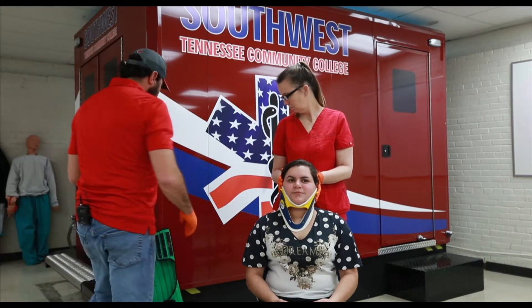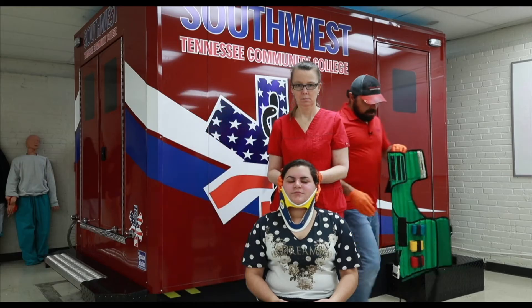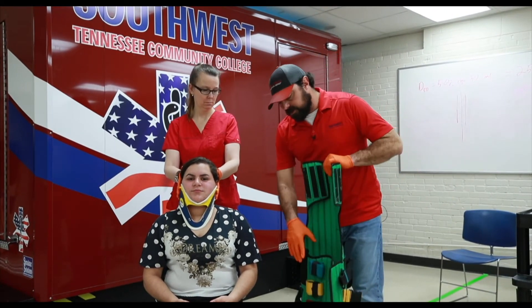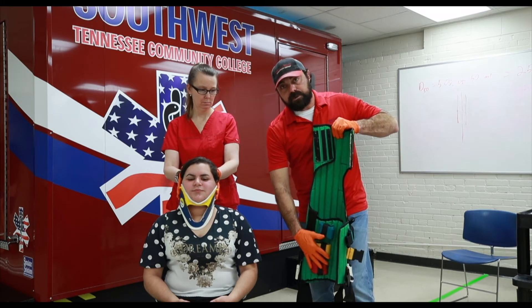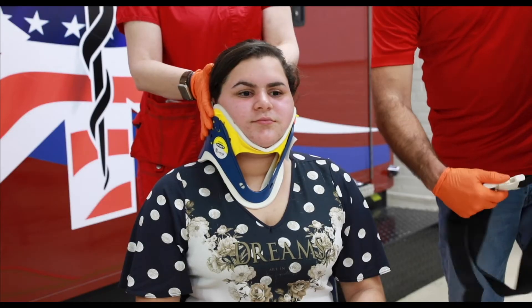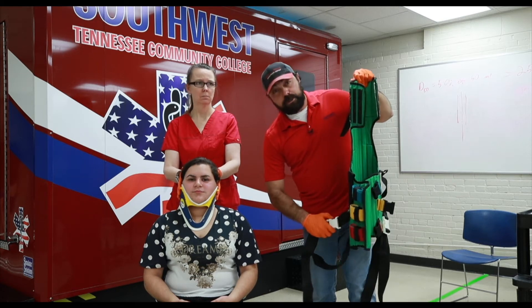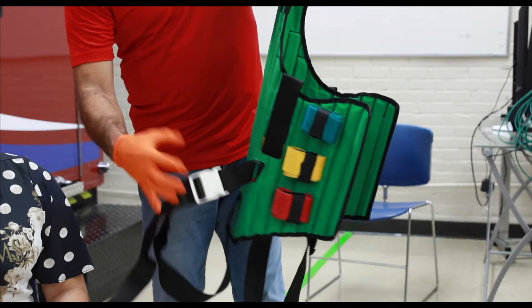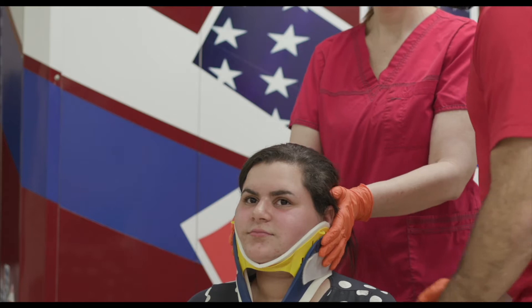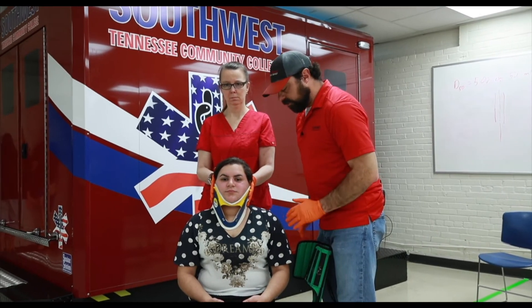Now that you have that, you're going to go ahead and get your device. Moving this into position is sometimes a little bit tricky. It's always best to make sure the straps are wrapped up nice and neat before you start to move it — otherwise it's going to get caught behind the patient. It's also a good idea to have it buckled before you push it through so it's not hanging down getting caught on stuff. Once it gets on the other side, you'll need to undo it. We're going to move the patient forward just slightly on the partner's count so we can fit this behind her.